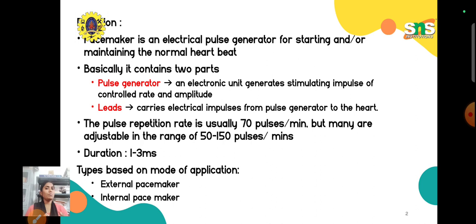This is a very simple device. We don't have any other complex components inside it. It's going to just generate electrical pulse. It mainly contains two main parts. One is the pulse generator. As I said before, it generates the pulse in order to maintain the normal heartbeat.